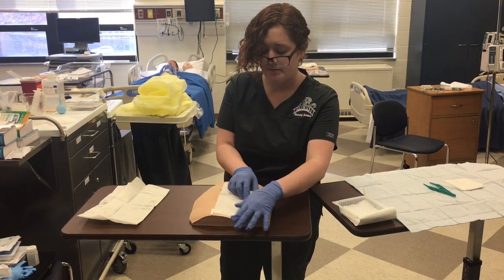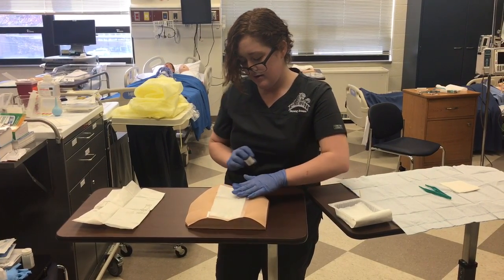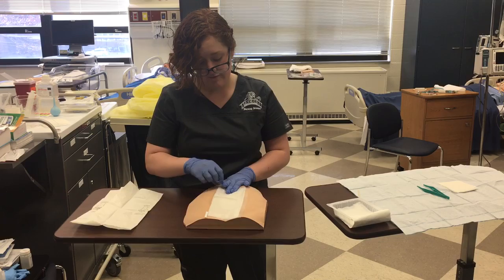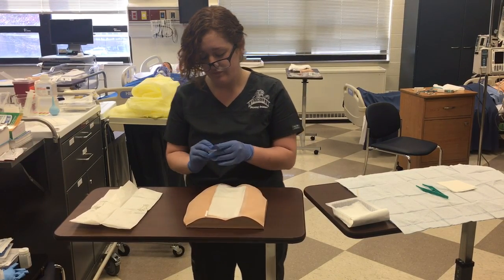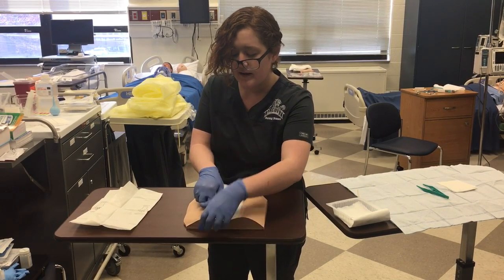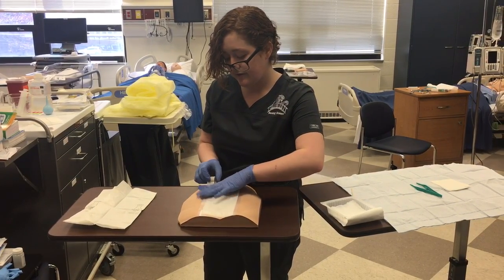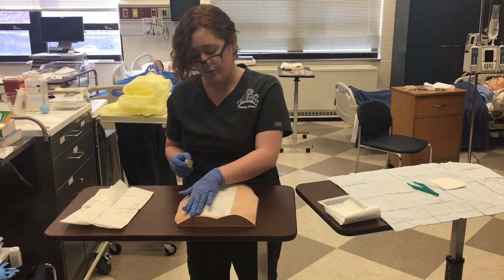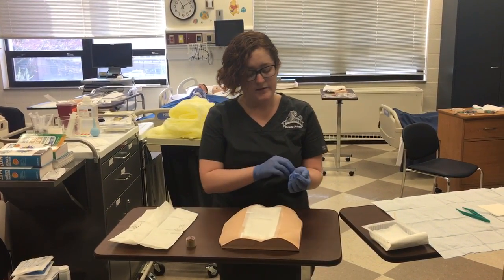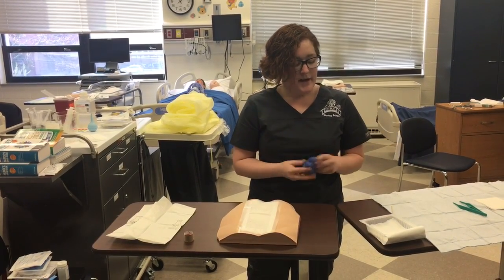Throughout this procedure, I'm going to be making sure that the patient is comfortable and note any signs of distress that they may exhibit for documentation later. For documenting, I am also going to document any notes that were made about the tunneling of the wound. There we go. And it's fastened. I'm going to initial, sign, and date, and remove my sterile gloves. Clean up my area and document.